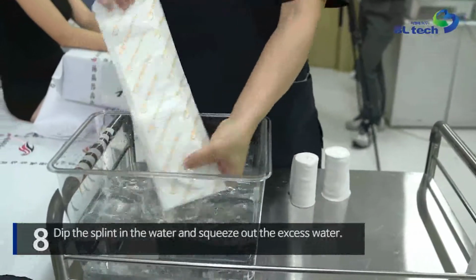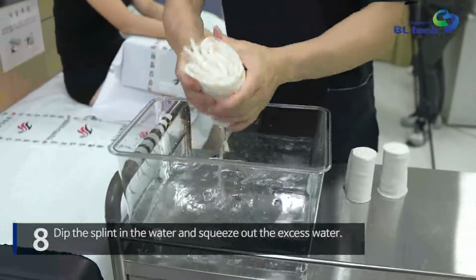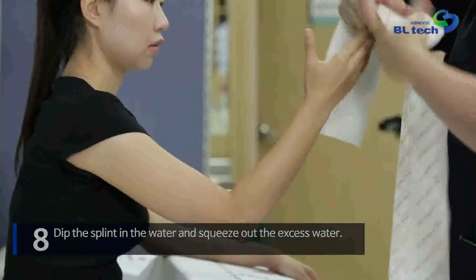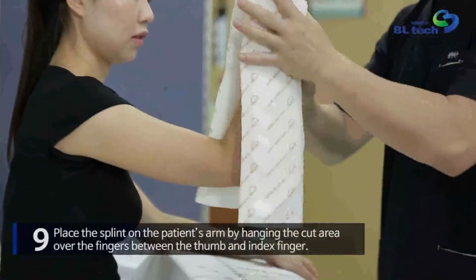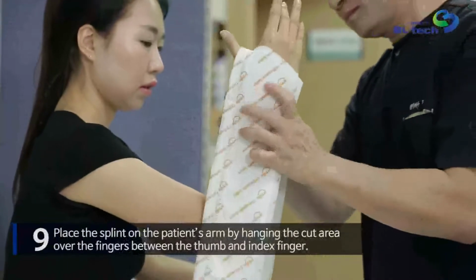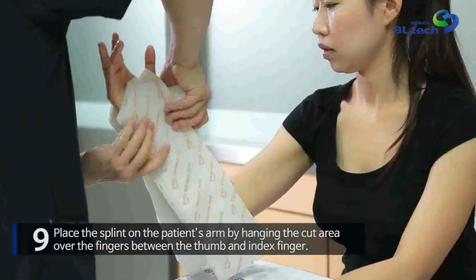Dip the splint in the water and squeeze out the excess water. You may use a towel when squeezing out the splint if you are concerned about the moisture. Place the splint on the patient's arm by hanging the cut area over the fingers between the thumb and index finger. Align the splint with the wrist and arm.